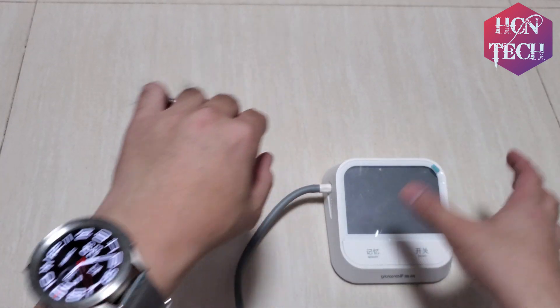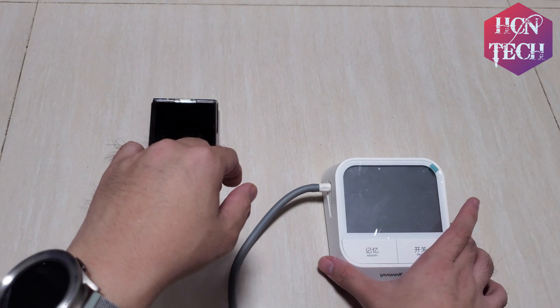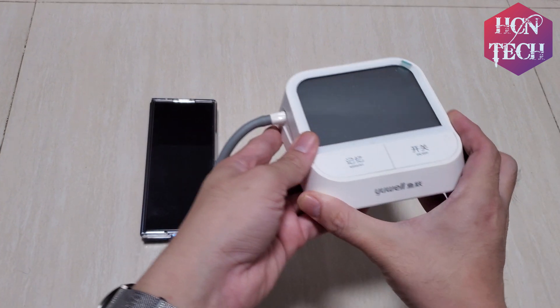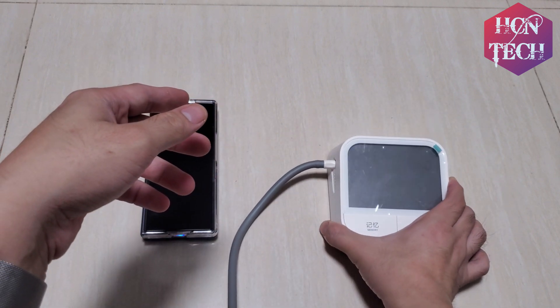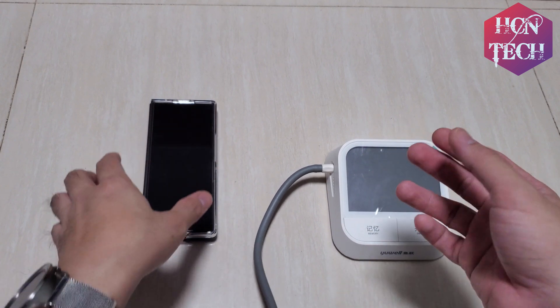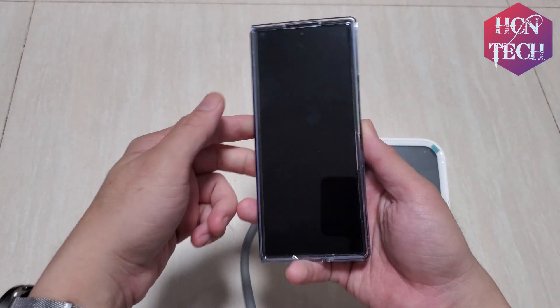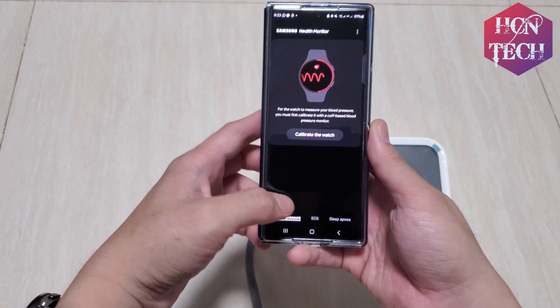After that, you have to wear your watch on your left side, and you have to have a blood pressure monitor — in my case I have a YUWELL blood pressure monitor. You have to measure your blood pressure on the right hand side. Then open Samsung Health Monitor in order to calibrate the watch.